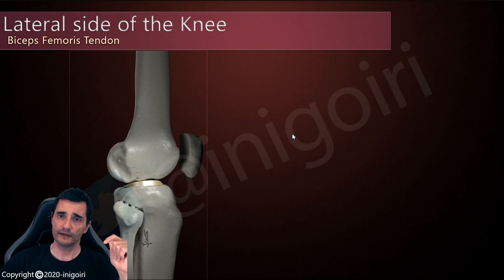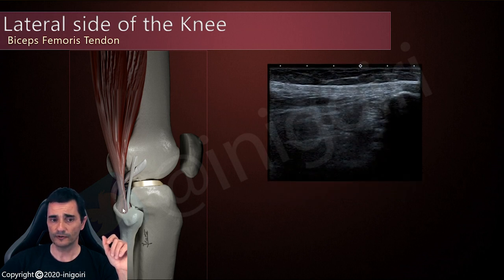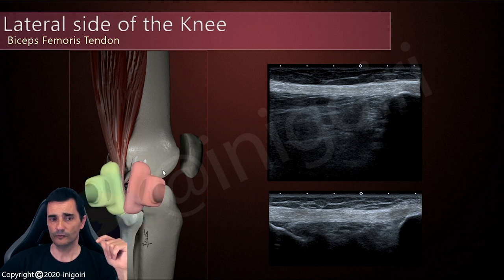Another structure we can evaluate is the biceps femoris tendon at its insertion. The biceps femoris has two heads, the long head and short head, and both come together to insert at the proximal fibula. So again, you check the fibula, place the probe over the bone, and once you have found the cortical, if you are posteriorly located, you will find the tendon of the biceps femoris. This image is quite similar to that of the lateral collateral ligament. How do you know which one you are evaluating? By the orientation of the probe — if we are slightly oriented anteriorly, we are on the lateral collateral ligament; if slightly posteriorly, we are on the biceps femoris.